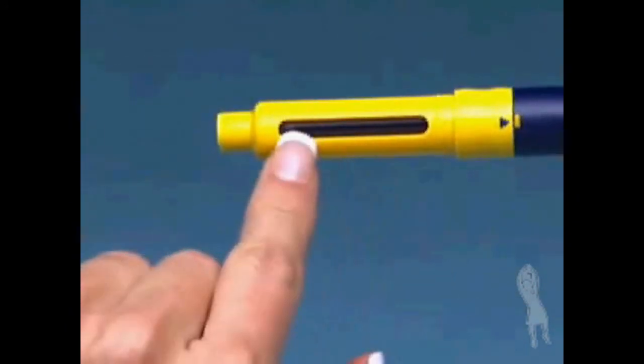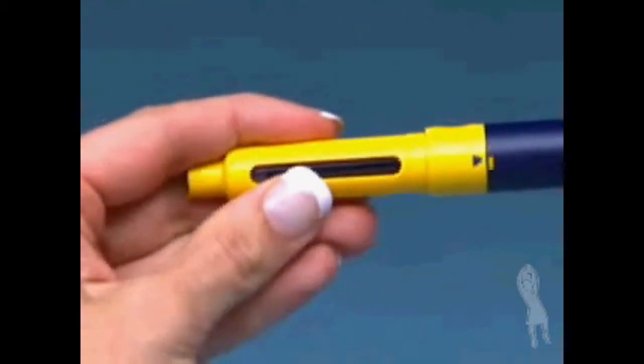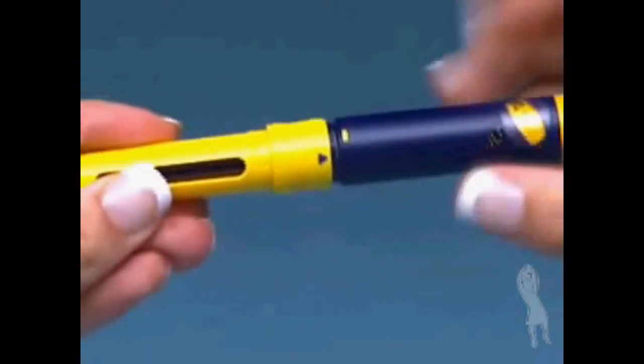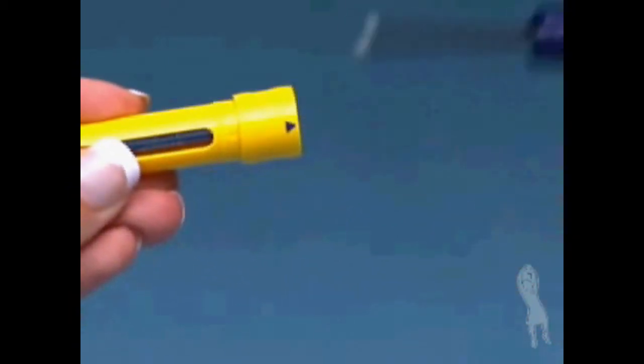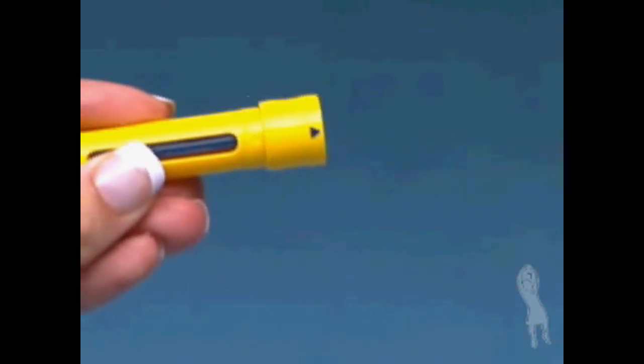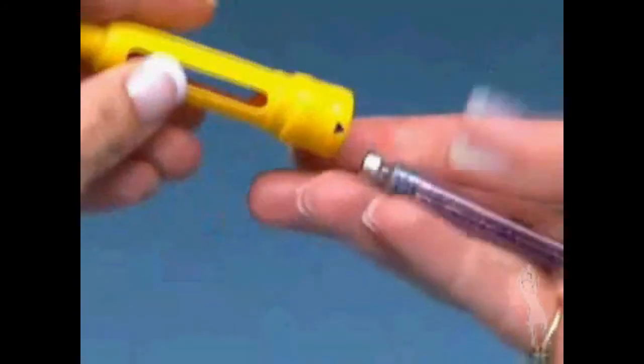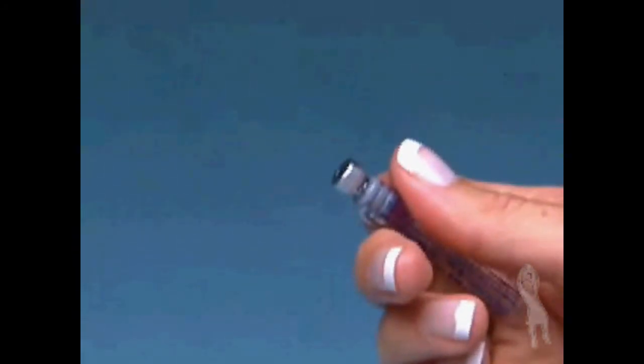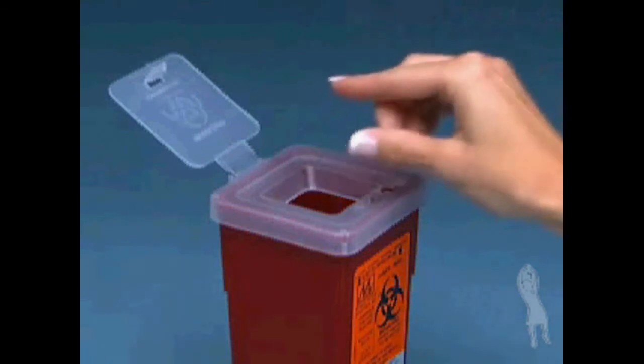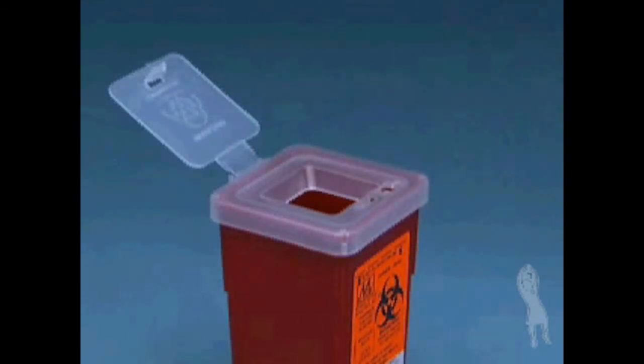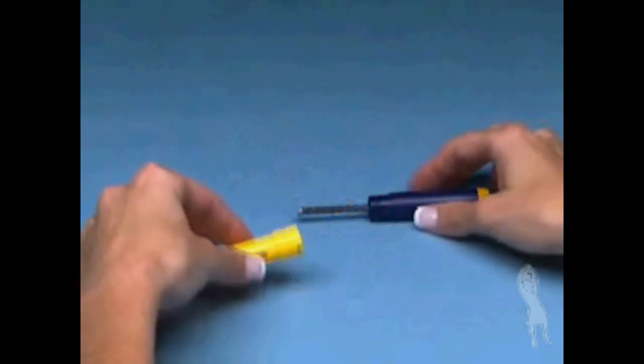If the Follistim AQ cartridge is empty, unscrew the pen body from the cartridge holder. Put the pen body down on a clean, dry surface and remove the empty Follistim AQ cartridge from the cartridge holder. Safely dispose of the empty Follistim AQ cartridge right away in the same safety container that you used for needle disposal.